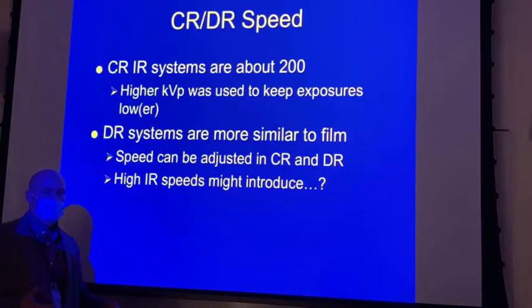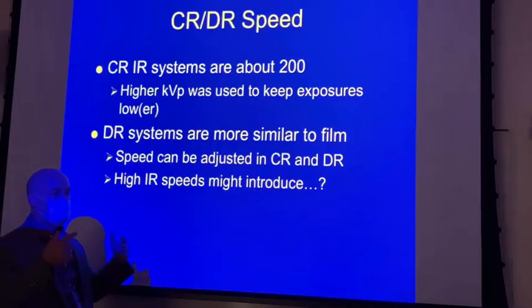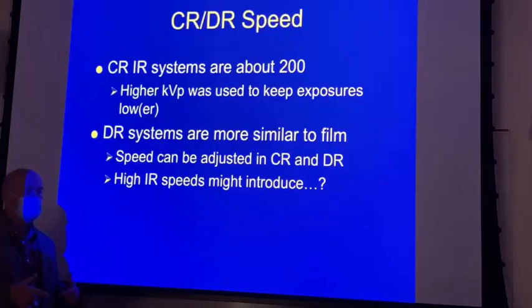A lot of your hospitals aren't getting compensated, or are getting the threat of not being compensated, unless they go to DR. So DR forced us to reduce mAs, right? Yeah, we could have reduced kVp and dose would have gone down, but the reduction of dose was more significant by reducing mAs, because you'll have less time under radiation.